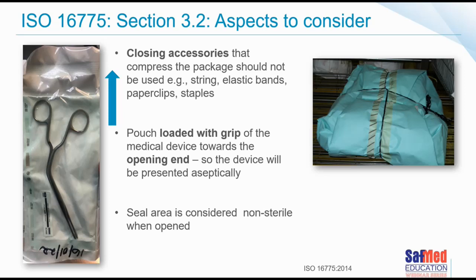The item on the right, a nylon cord, really a rope type material, is not something I've seen very often. I've seen it once or twice in a provincial setting, and it was applied before sterilization, and it was used mostly to facilitate carrying of the sterile barrier packaging. The idea was to make it easier to carry. But of course, that rope system is going to cut through the sterile barrier system and really and truly is not ideal.